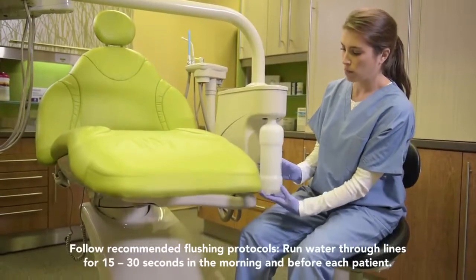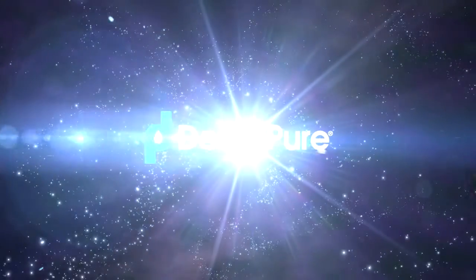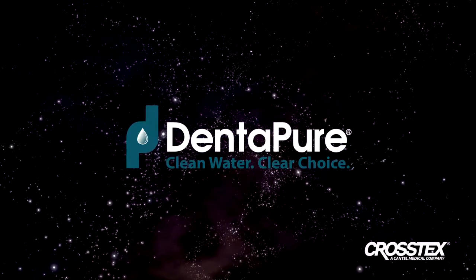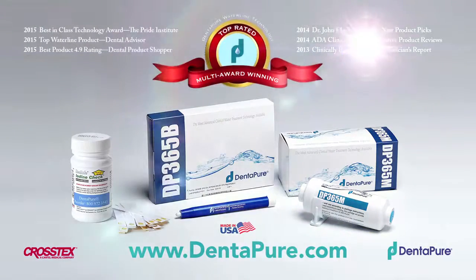That's it! There's nothing else to do until next year when you receive your reminder to replace your Dentipure cartridge. Convenient, complete, consistent, and compliant. For clean water, Dentipure is the clear choice. Order now — go to Dentipure.com today or call your preferred dealer.